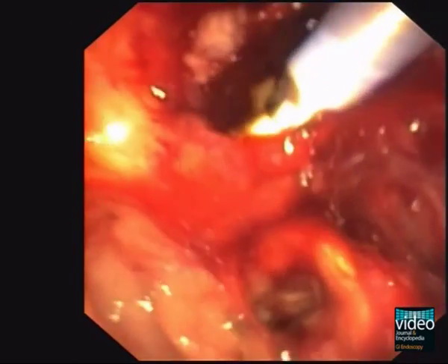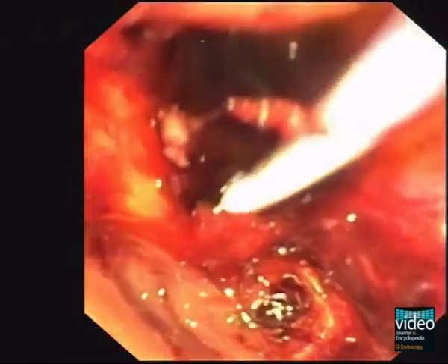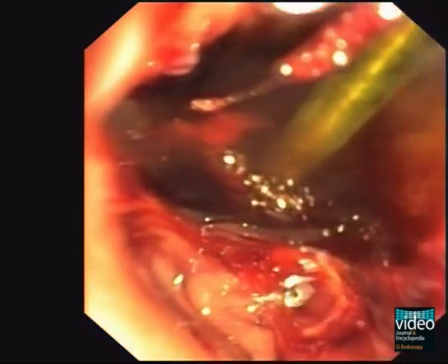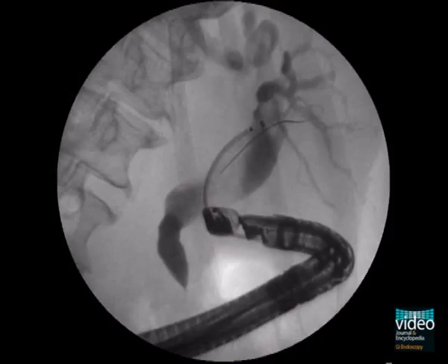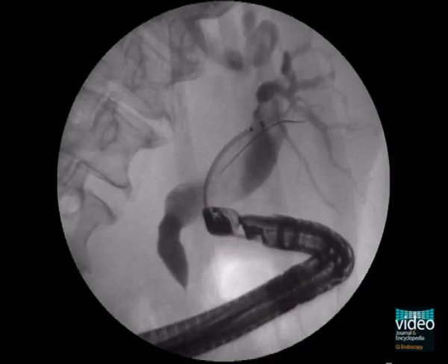When the ring knife, without cauterization, reaches the bile duct without any problems, or spontaneous bile drainage out of the puncture of the duodenal site is seen, the next procedural step can be done.